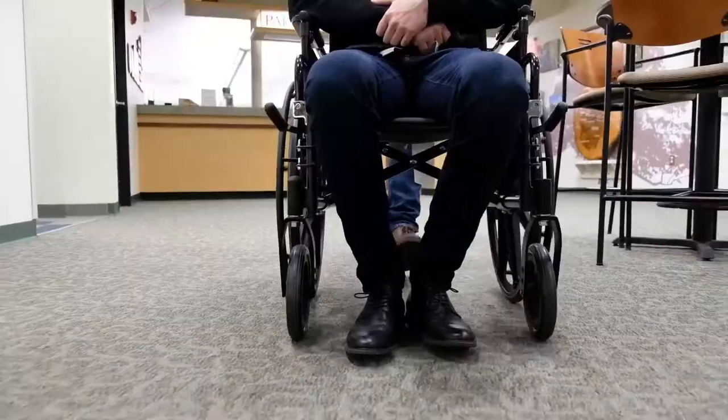The EvacuSafe Freewheel Transit Chair is a light-duty transit chair designed to go both up and down stairs. Its primary usage is in care homes and private residences.